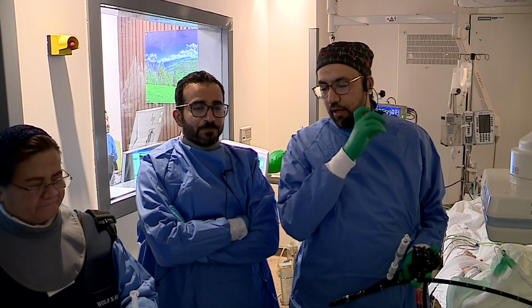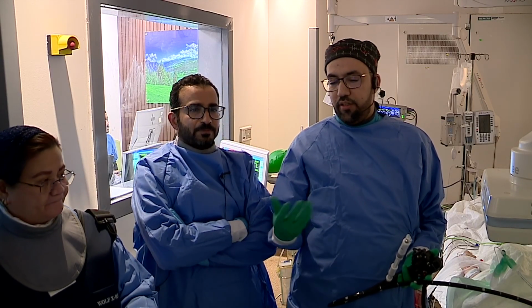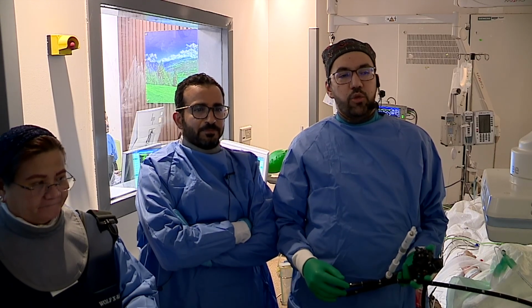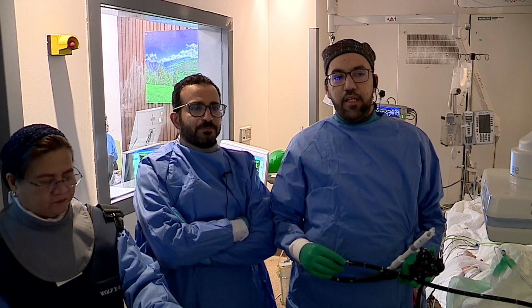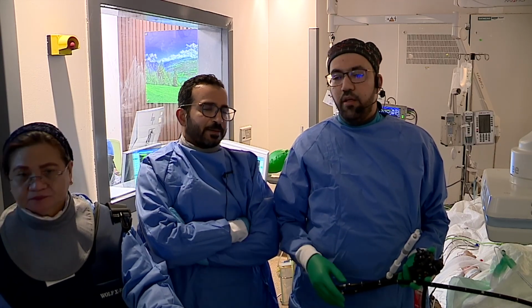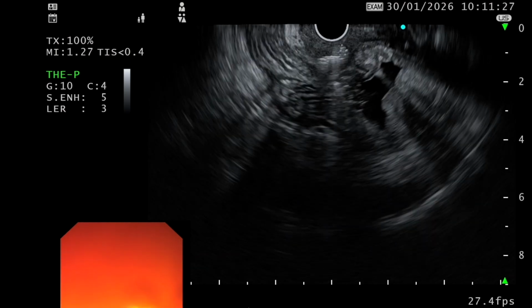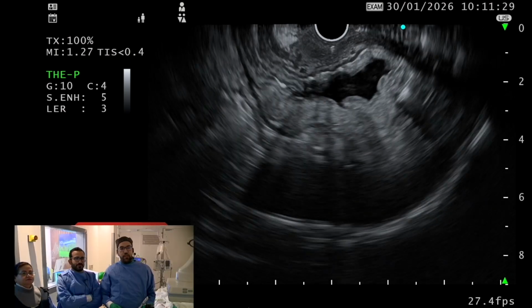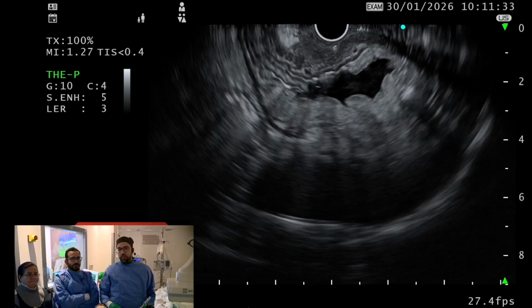As you mentioned, this patient has AA, which means altered anatomy. So we need ERCP in altered anatomy to evaluate the distal CBD stricture. Basically, as you know, the options are enteroscopy-assisted ERCP or laparoscopic. This patient is already post lap chole, so laparoscopy is not that option. And all of us are aware of the failure rate of enteroscopy-assisted ERCP.